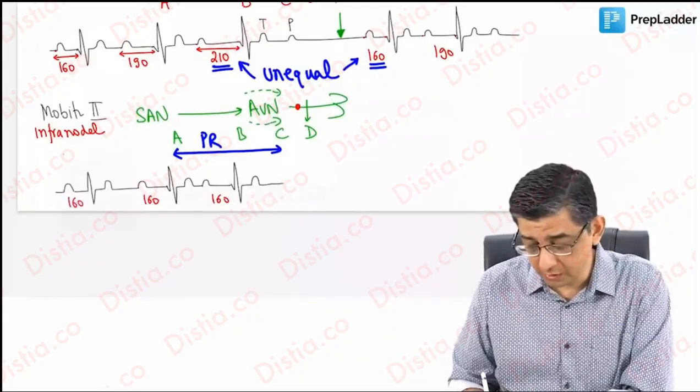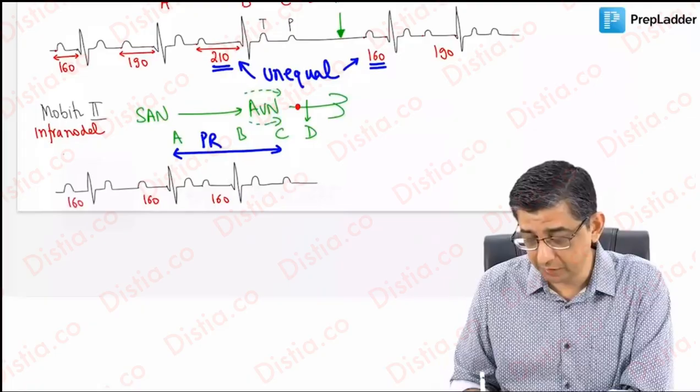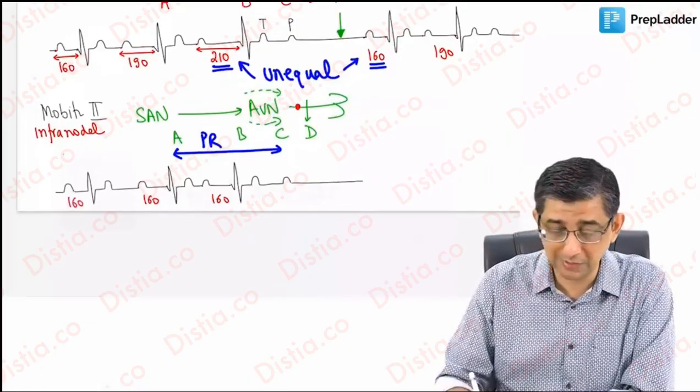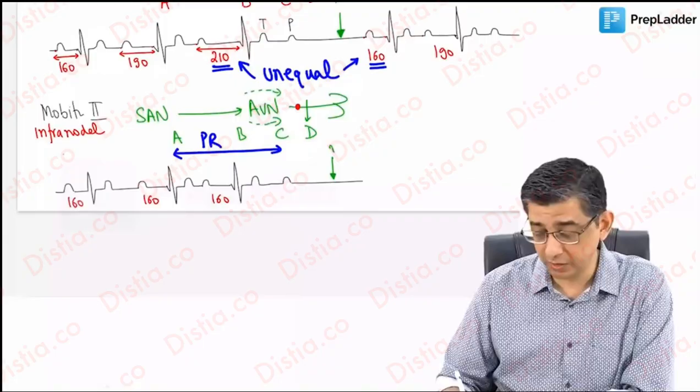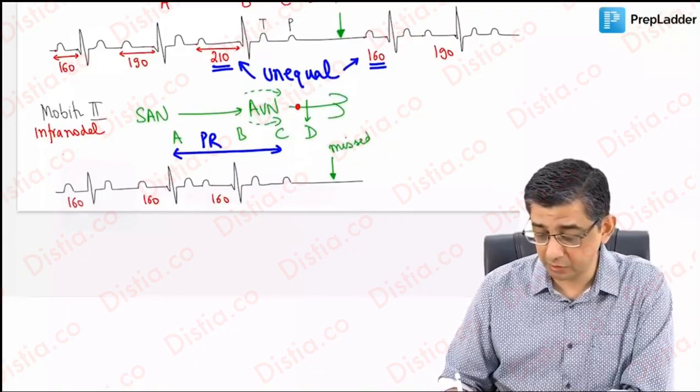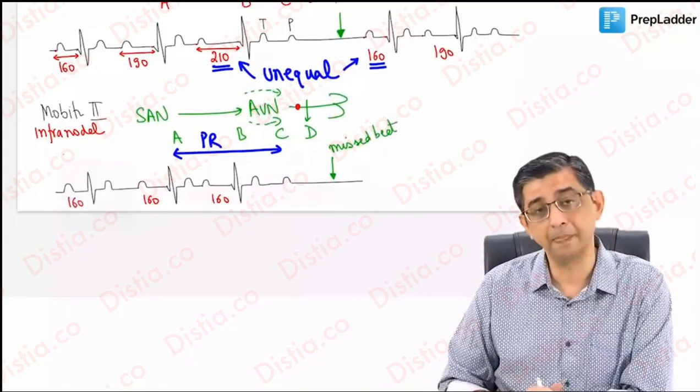But then you will notice that there is a P wave, and then you are waiting. There is no QRS complex, and if he's kind enough to you, then he might actually give you a vertical black arrow highlighting the area of the missed beat. And even at this point, the patient might volunteer information: doctor, I started feeling dizzy again.